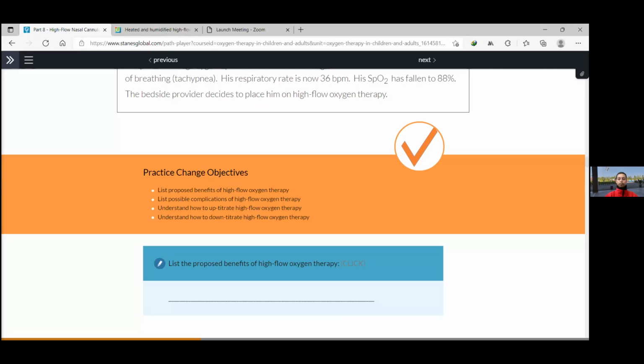And maybe the other thing is aspiration. So definitely, high flow nasal cannula may even increase the risk of aspiration. As one of the side effects, we'll see it later, there is distension of the stomach, and this might predispose the patient to regurgitate, and this can lead to the risk of aspiration. So these are the points. Yeah, thank you.